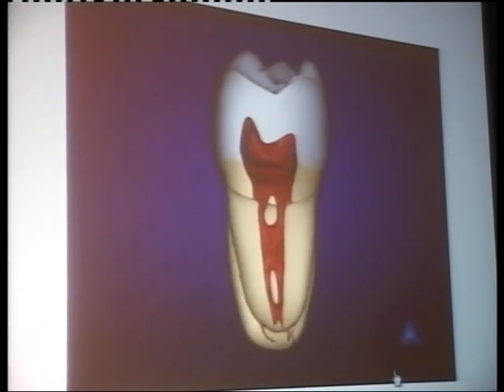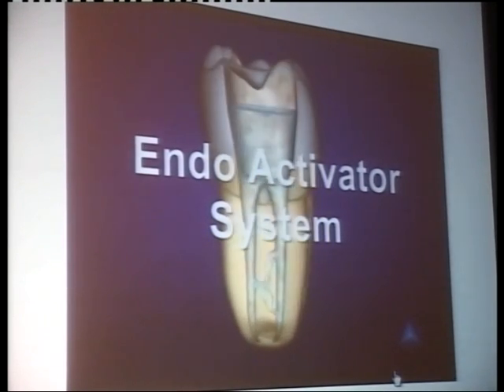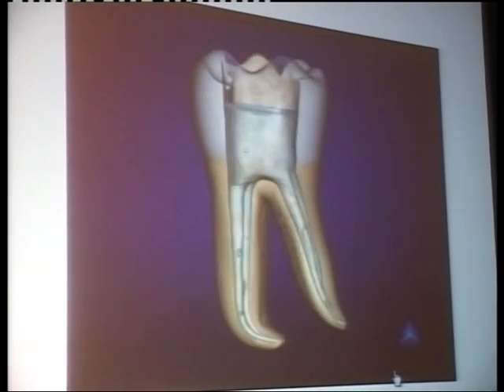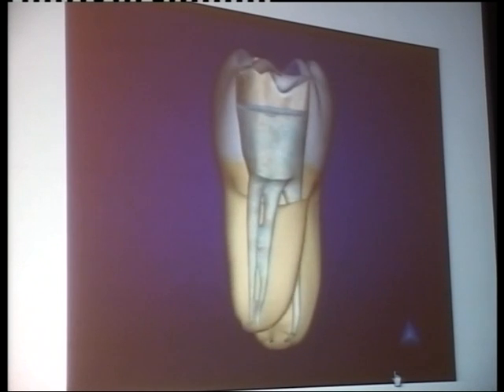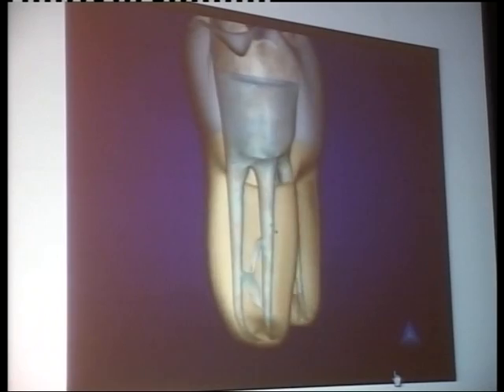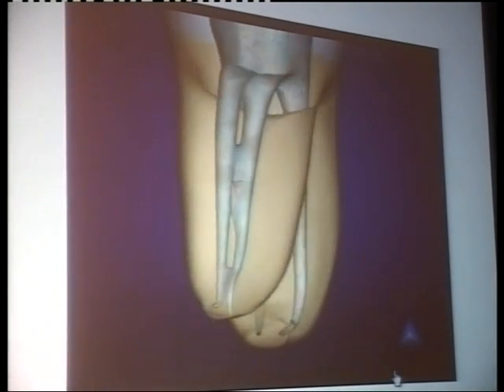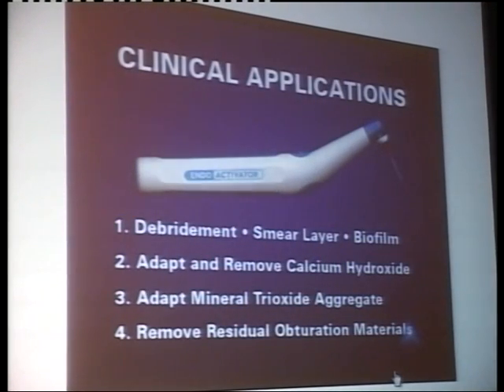This is the EndoActivator. It's very simple. It also has 3 tips: small, medium or primary, and the large.